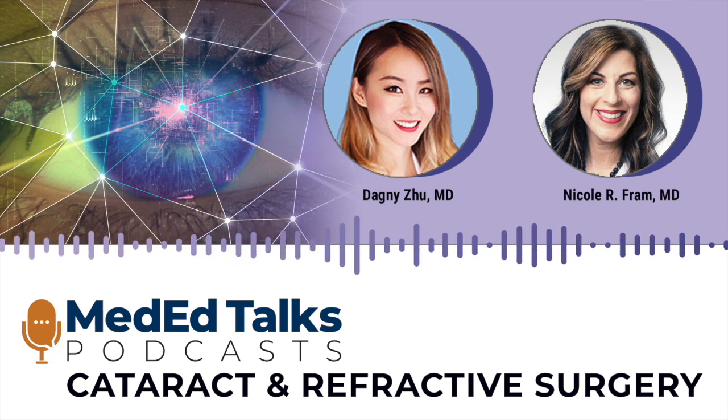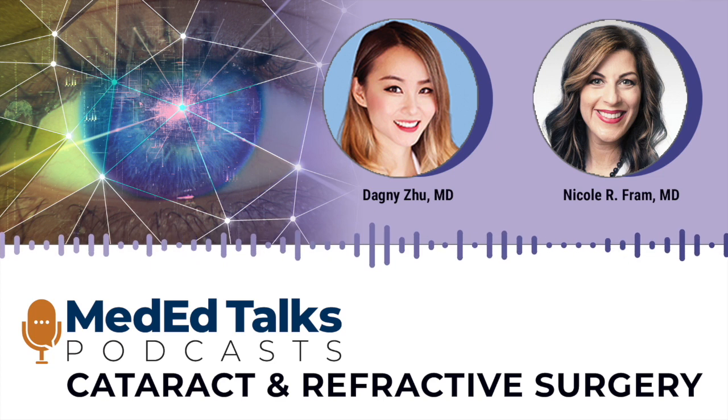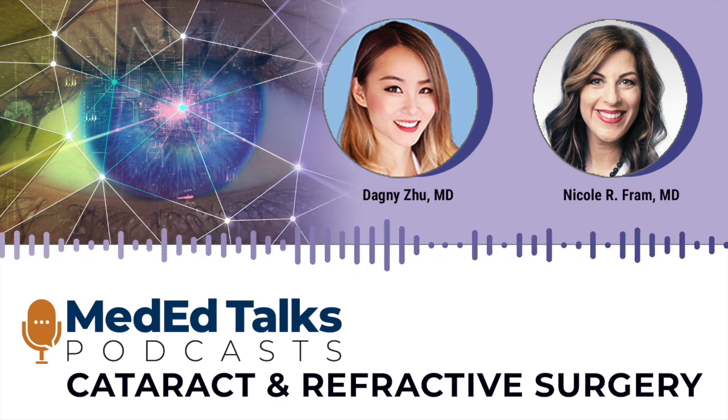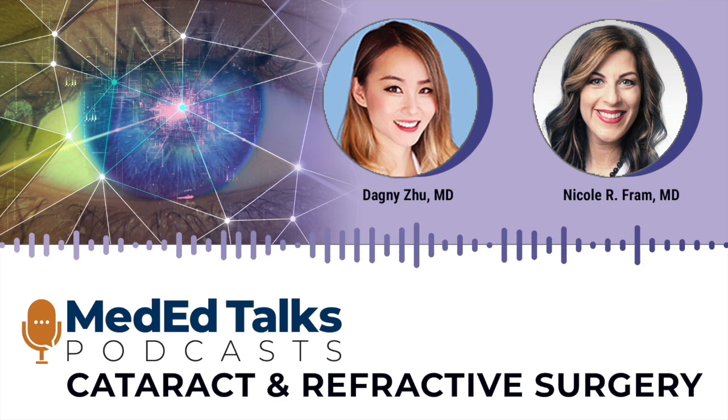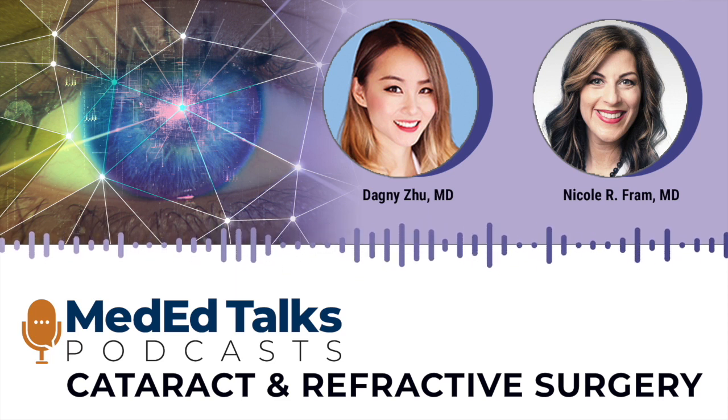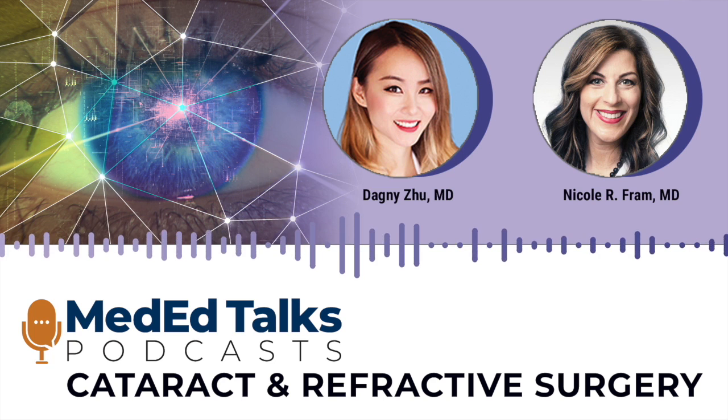So for DALK surgery or particularly for DSAEK, a lot of times we're doing DSAEK now on the most complex eyes, and we want to make sure there's no fluid in the interface. And seeing that, kind of massaging or tamponading that fluid out, is just one of the most satisfying things I've ever done in my career. But maybe that says something about me.